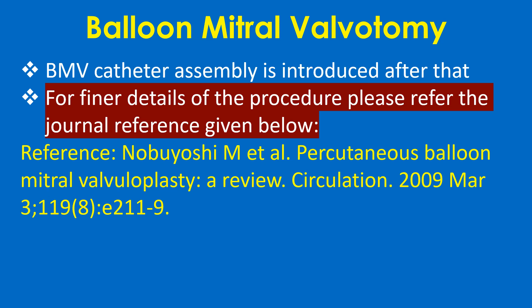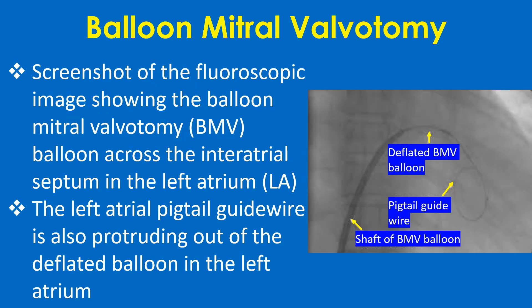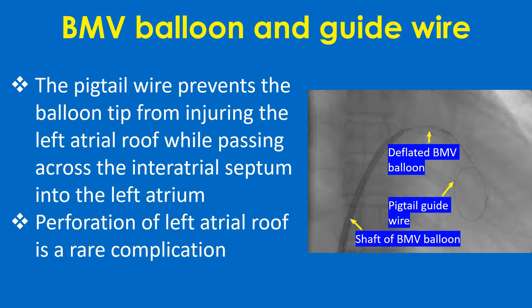For final details of the procedure, please refer to the journal reference given. This screenshot of the fluoroscopic image shows the balloon mitral valvotomy catheter across the interatrial septum in the left atrium. The left atrial pigtail guide wire is also protruding out of the deflated balloon. The pigtail wire prevents the balloon tip from injuring the left atrial roof while passing across the interatrial septum into the left atrium.